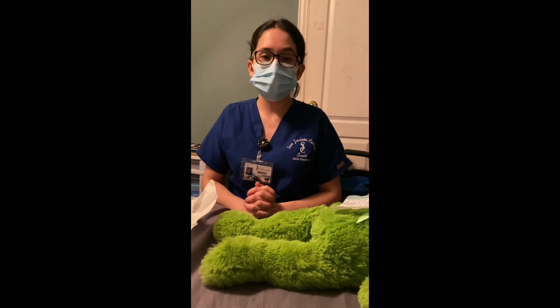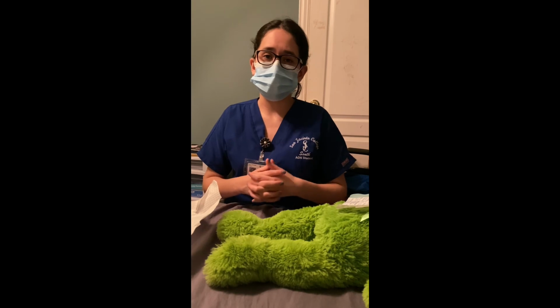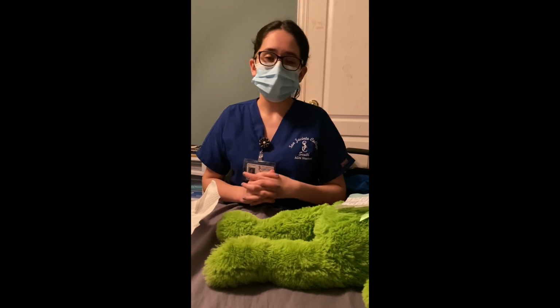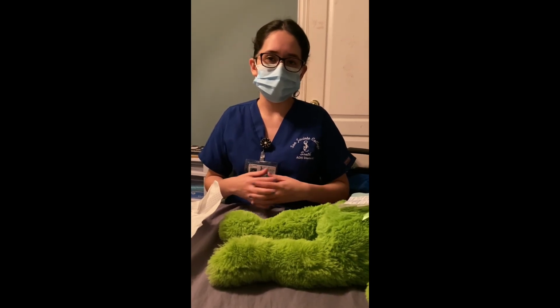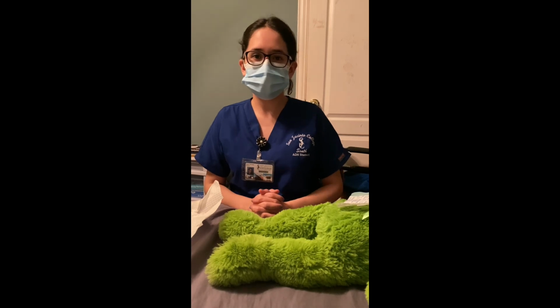For documentation purposes, you want to make sure that you document that you did a central venous line dressing change, that there were no complications at the time of the dressing change, and that the patient did not have any signs and symptoms of infection to the site.